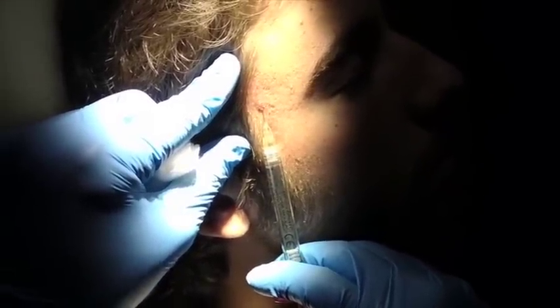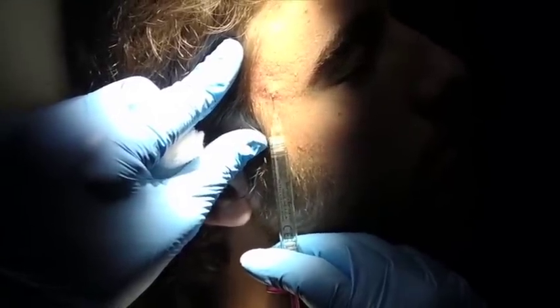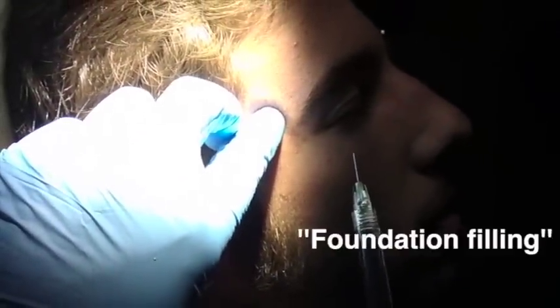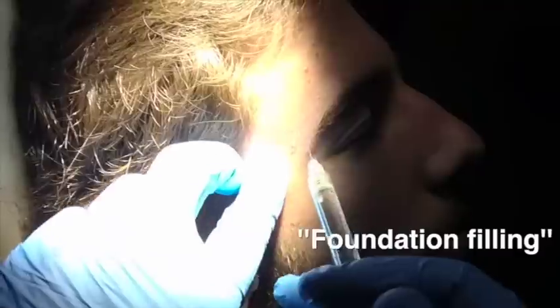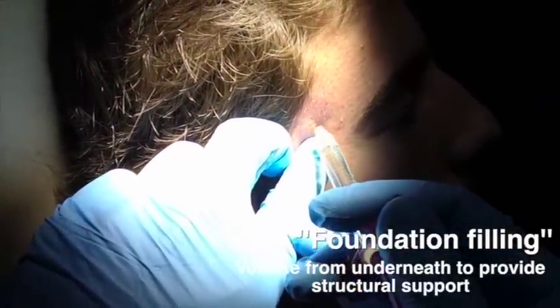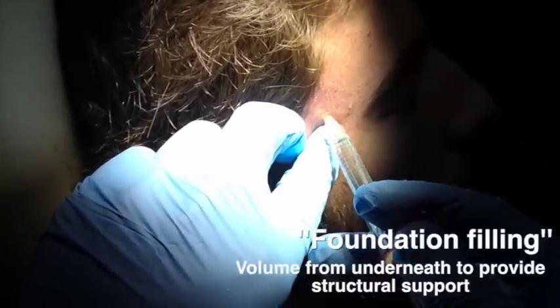If I fill, you get what's known as a donut effect — if there is fibrosis around that area and you fill, the filler will go to the area of least resistance which surrounds the entire scar. In this situation, I am filling — it's called foundation filling. I call it foundation filling because I'm actually laying down the foundations and pushing the scars from underneath.